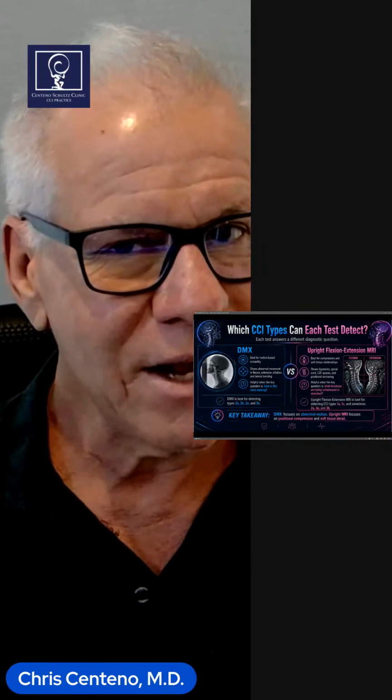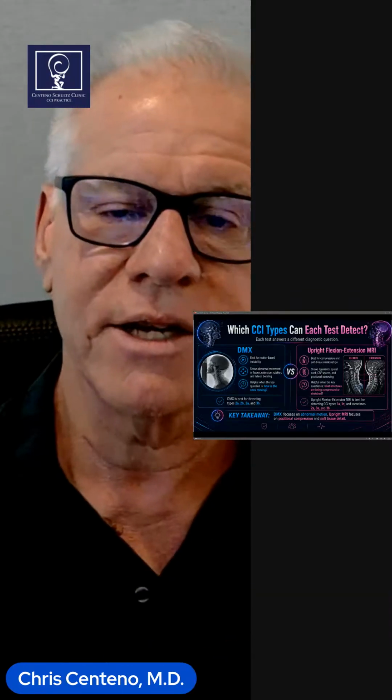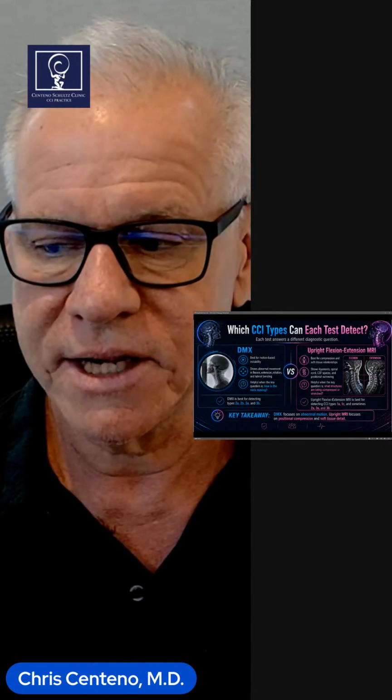Now, sometimes on upright flexion extension MRI, you can see other things, right? You can see a 2A where you get opening of that atlantodental interspace in flexion, but it's not going to be so sensitive for that because you don't have as much pushing towards the end range as you do in a DMX, because that's one of the inherent problems with an MRI. It takes a while to get the picture, so it's hard to keep the patient in that position long enough to see what you need to see.